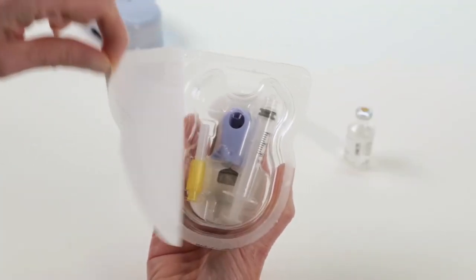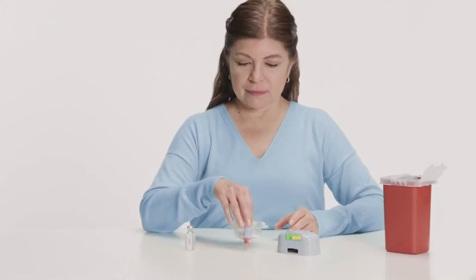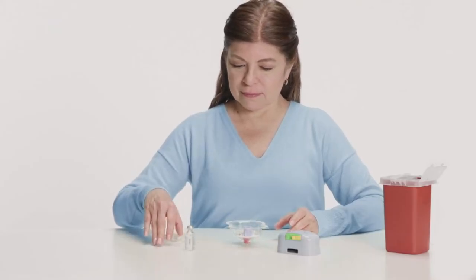Peel off the label from the patch packaging. Remove the inner tray containing the syringe and needle and set it aside.